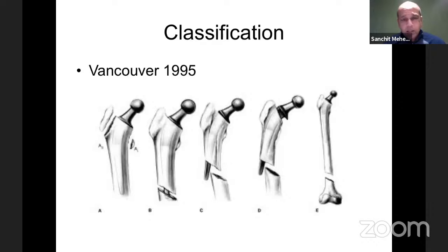So original classification 1995, a pictorial representation of the same. So your greater trochanteric fracture, lesser trochanteric fracture, then you have the type B fractures where the implant is stable, the implant is not stable, and the last one with implant being unstable and the bone stock being poor. So the type C fractures in a native scenario where there's no distal knee replacement are fairly straightforward. The problem starts arising when you have a knee replacement distally, and even further so if you have a revision knee implant distally.